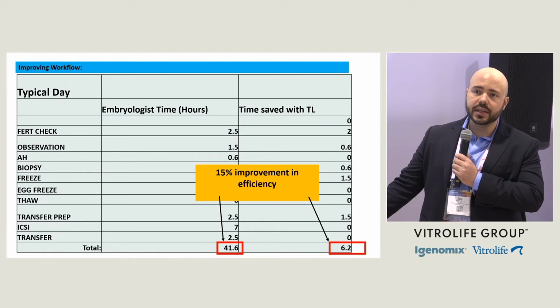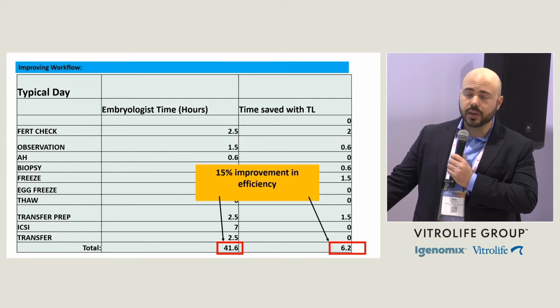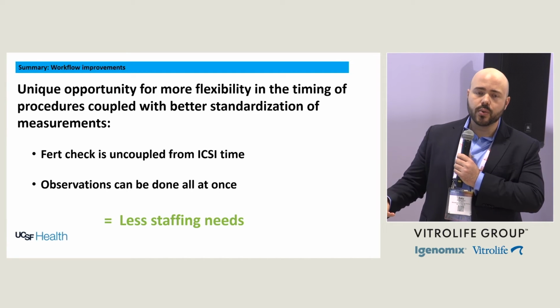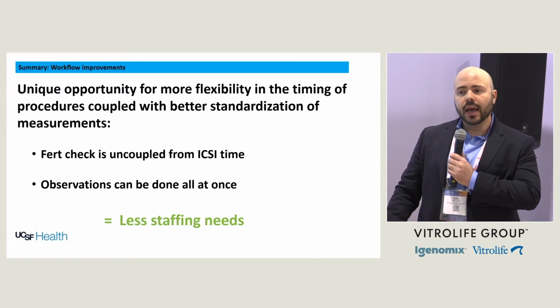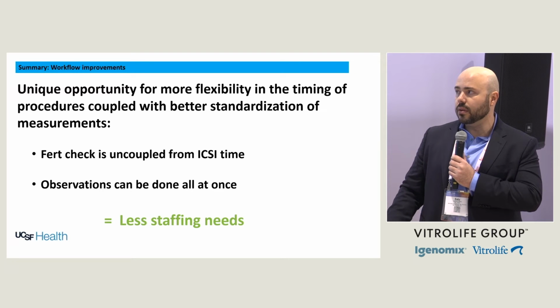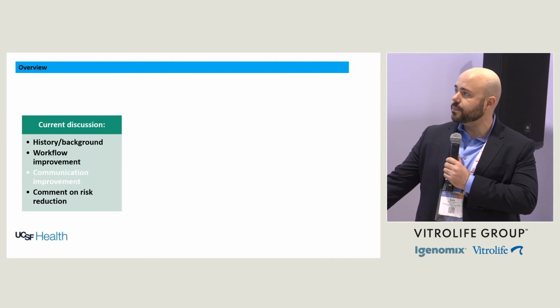Not to say that the liability, now that you're handling fewer gametes, can really give you an opportunity to decrease your liability. So a summary of this presentation is you need less staffing. As we all know, we're facing a difficult time now with the workforce in laboratories. And also it's not that we're not giving the time for an embryologist, but the embryologist might be doing other tasks within the lab that might be more important than just observing the embryos with the older method compared to the time-lapse system.